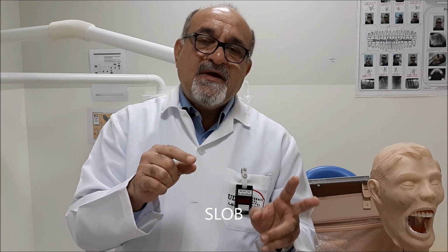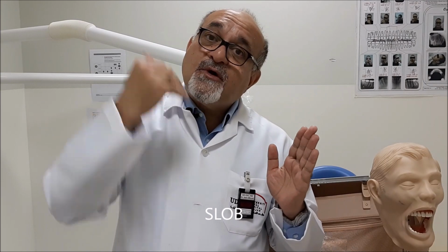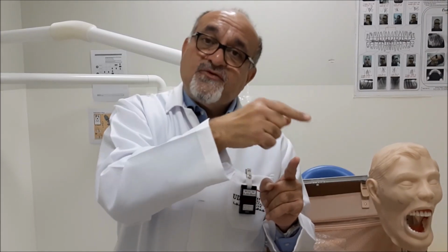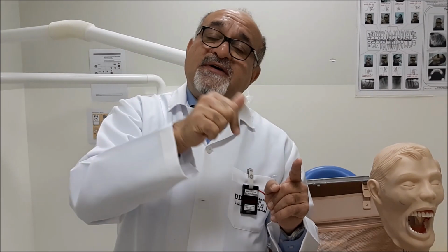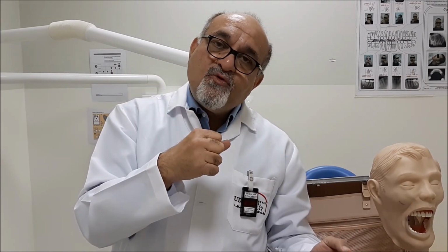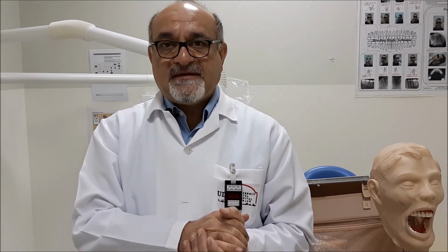That is, same lingual, opposite buccal. It means that the lingual, which is far from you, will move in the same direction as you, while the buccal, which is closer to you, will move oppositely.